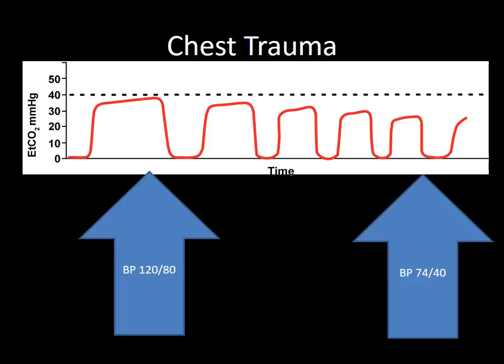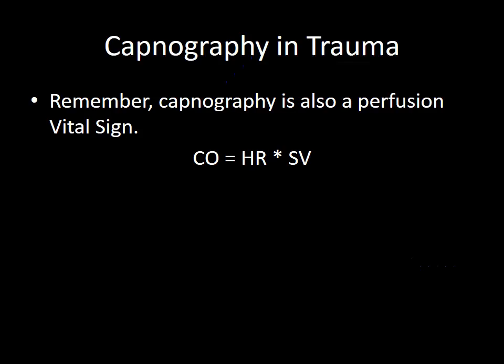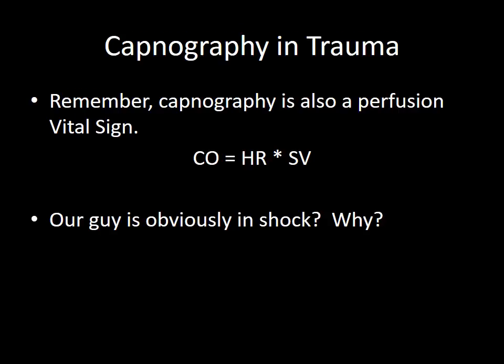He is breathing faster, but my thought would be maybe his carbon dioxide is decreasing because he has a decrease in perfusion, and this is correlating with a decrease in cardiac output. So he's in shock, definitely, and this could be a hypovolemic shock.